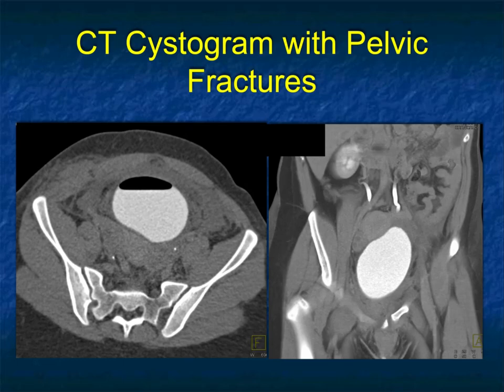So if you're looking to exclude bladder injury, put a Foley catheter in place, and again, drip contrast, drip from a 500 cc bag of saline, 30 cc's of contrast injected. Everything is shook and shaken and stirred, and then you drip it in.